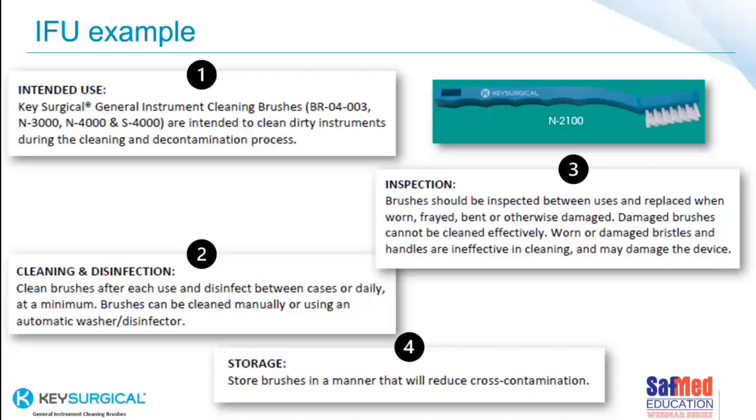Here, point 3 in these instructions for use: brushes should be inspected between uses and replaced when worn, frayed, bent, or otherwise damaged. Damaged brushes cannot clean effectively, and they cannot themselves be cleaned effectively. So we're not going to get the brush clean. Worn or damaged bristles and handles are ineffective in cleaning and may in fact damage the device that you are trying to clean. Number 4, this IFU states that brushes should be stored in a manner that will reduce cross-contamination.